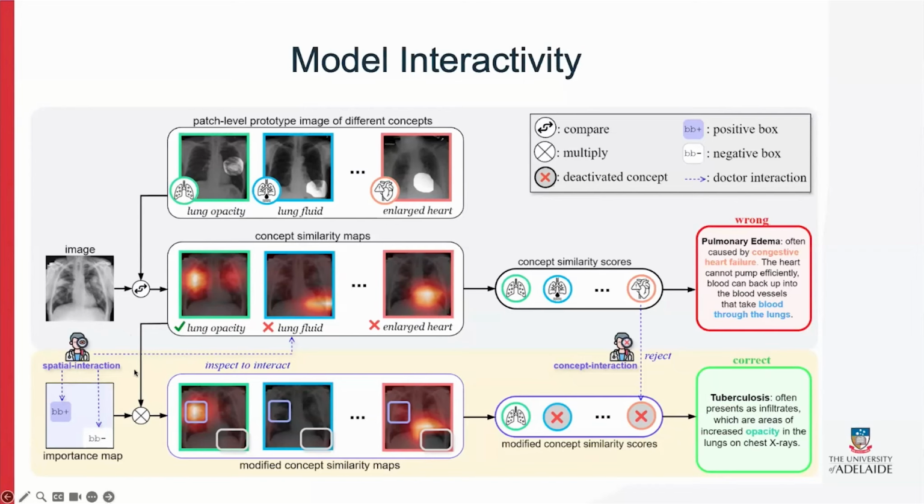For spatial interaction, the doctor can tell the model where to focus and where to ignore with the positive bounding box and the negative bounding box here.